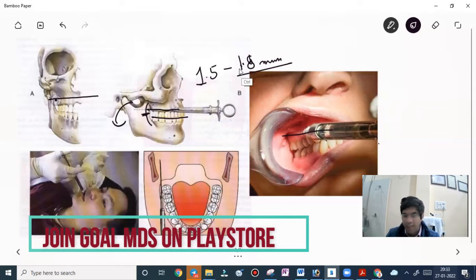So remember, the motor nerve paralysis develops as quickly as, or more quickly than, the sensory anesthesia. The patient with trismus begins to have an increased ability to open the jaw after the deposition of anesthetic solution.